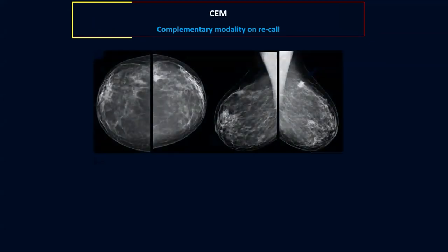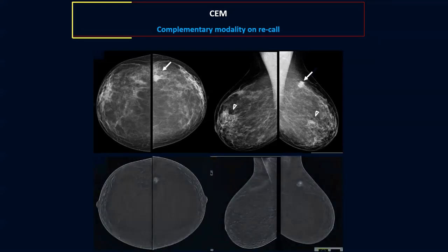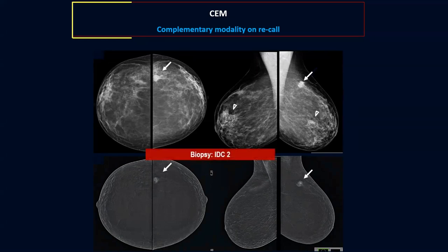This is an example of how we use contrast mammography as a complementary tool. A female recalled from the screening program had a small lesion in the upper outer quadrant of the left breast, with the rest of her breast parenchyma heterogeneous with multiple areas of asymmetries. Upon recall, she performed contrast mammography and only the lesion in the upper outer quadrant showed contrast uptake. It was biopsied and revealed an invasive duct carcinoma.